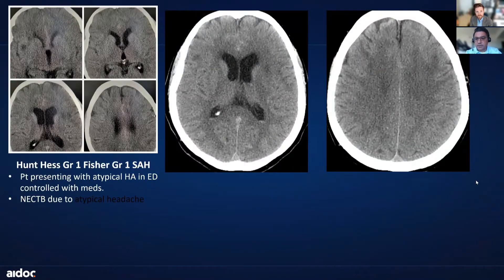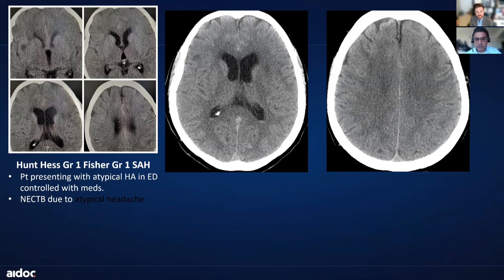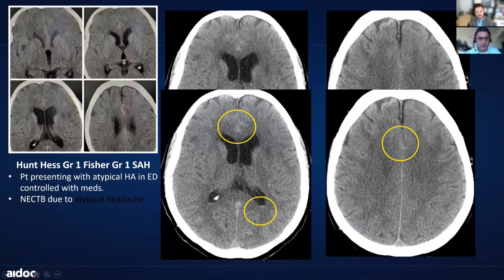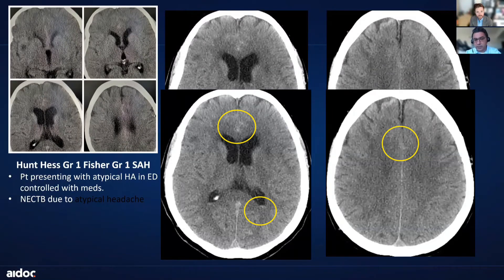This is a very subtle case of an interhemispheric hemorrhage in a patient that presented to the emergency room with a moderate headache, which was actually controlled with medications she received in the ER. A CT scan of the brain was performed because she does not usually get headaches. The ADOC neuromodule was able to identify these subtle interhemispheric hemorrhages and some bleeding along the falx, which is very impressive. You can see the patient had some enlargement of the ventricles. This was related to a ruptured anterior communicating artery aneurysm, which we later found on the CT angiogram. Because of these findings, the patient had an immediate CT angiogram that identified the anterior communicating artery aneurysm, rather than being sent home after control of the headache.